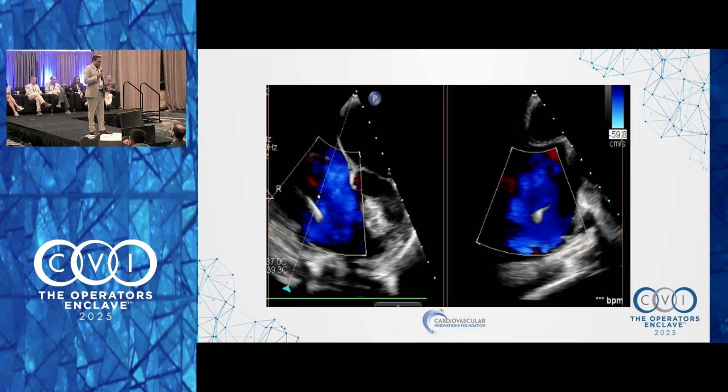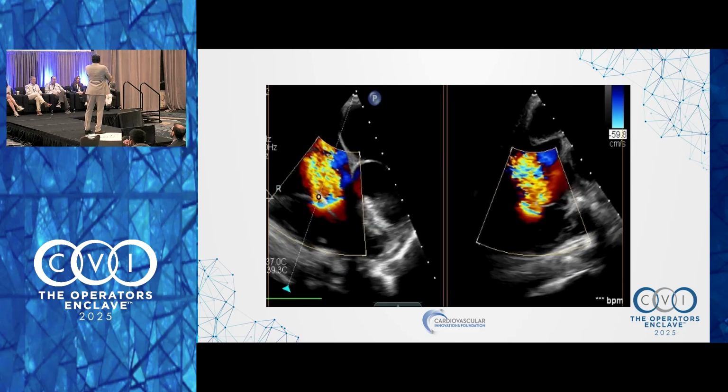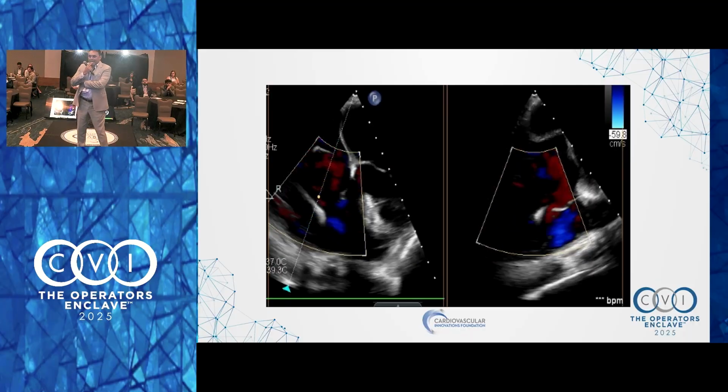Do you have a perimeter, Hursh, from a CT or anything? So I did analyze it. It was a good case for a valve replacement. For Evoke? Yeah, for Evoke. I forgot the numbers, but it was a good case for Evoke. Farasa, what do you think? You do a lot of Evokes here.